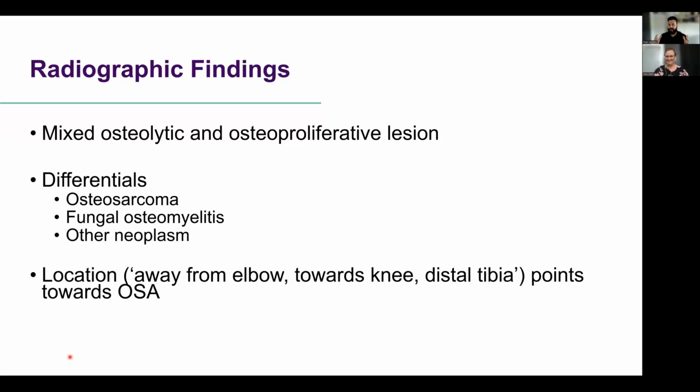So I would put a needle into this lesion. Typically, myself, I do it through ultrasound guidance, but you could do this as a blind fine needle aspirate as well, palpating the lesion. And then, of course, you want to send it to your favorite cytologist, Dr. Kate Baker, and see what she has to say. So, Kate, what did we find?